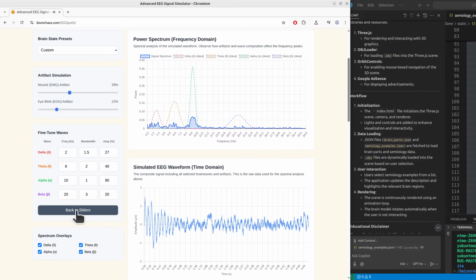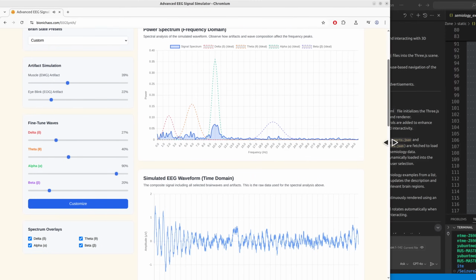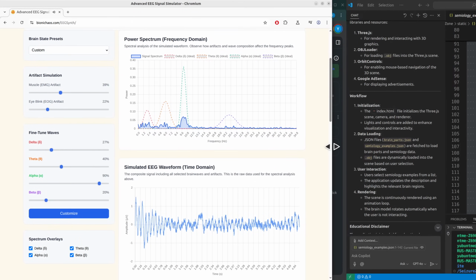Because, think about it, our brains are constantly going, all this electrical activity. Non-stop. And being able to measure that, understand it, that seems absolutely key for insights into different cognitive states, right? Or diagnosing neurological problems. Or even just grasping general brain function on a deeper level. It's fundamental. Right. And that's really where a simulator like the one in our source comes into play.